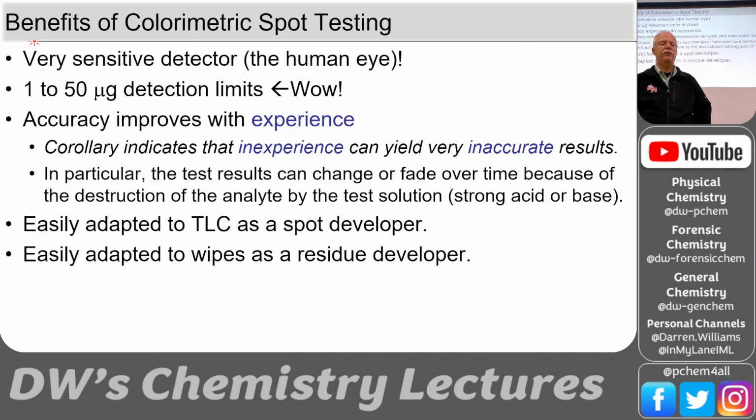This is nice. If we could coat a wipe and wipe the surface and look for a color change, that would be fantastic. We tried to do this in our lab for looking for oxidation sources in people's luggage. If the wipe they use for wiping down your luggage and testing for explosives had a color change, let's say you don't have an explosive, but you've got a lot of potassium chlorate, which could create a fire that couldn't be put out on a plane. That would be a problem, okay?